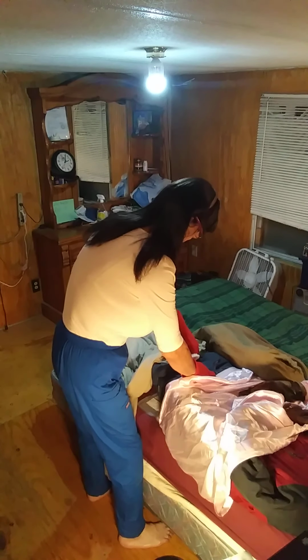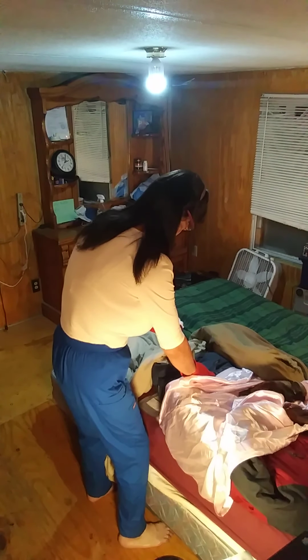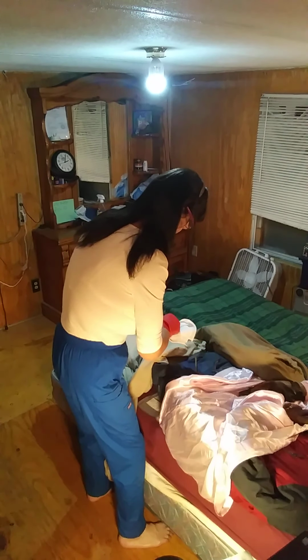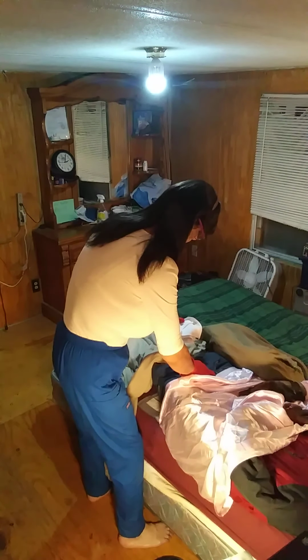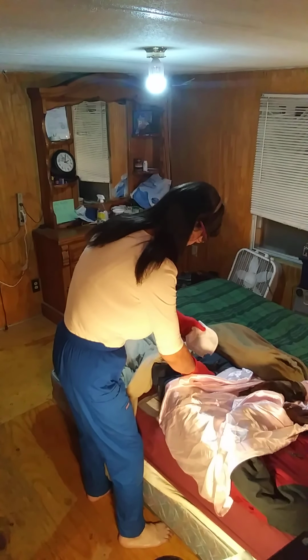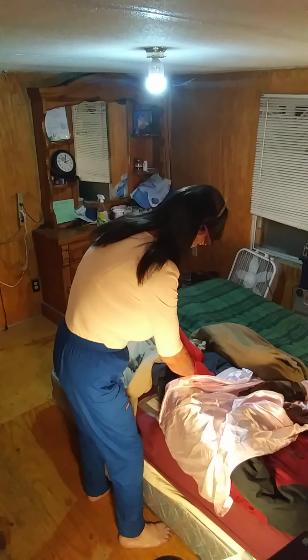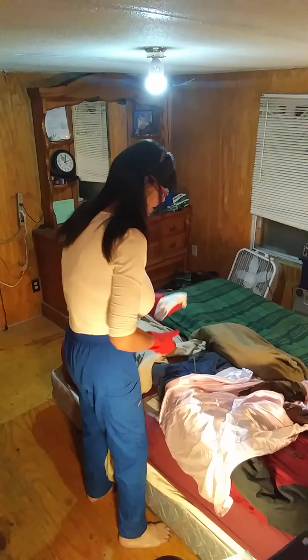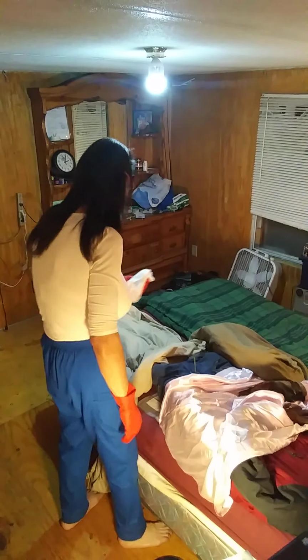And I'm going to go at least 4 inches out. Then I'm going to change one side of the washcloth. I'm going to grab the catheter without pulling it, as close to the meatus as possible. And I'm going to do it again, 4 inches out. Then I'm going to put my rag in a soiled linens bin.